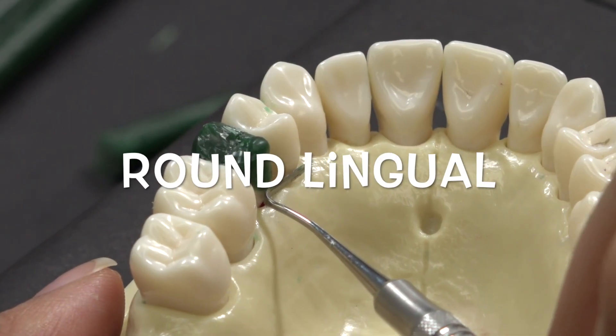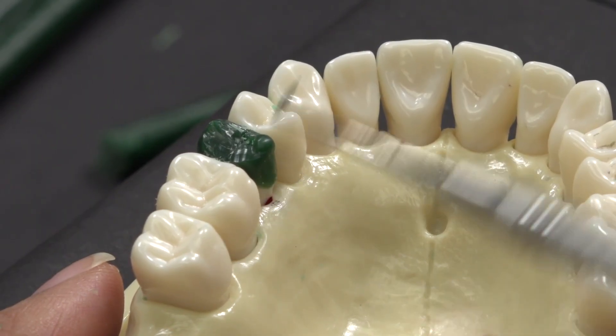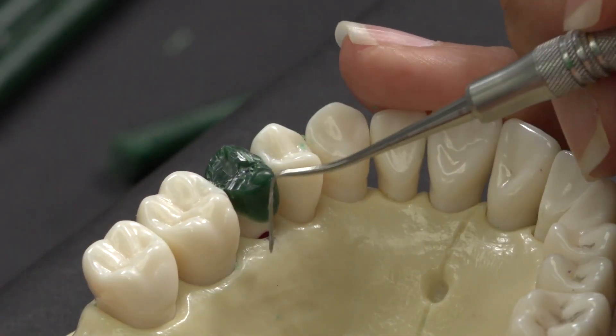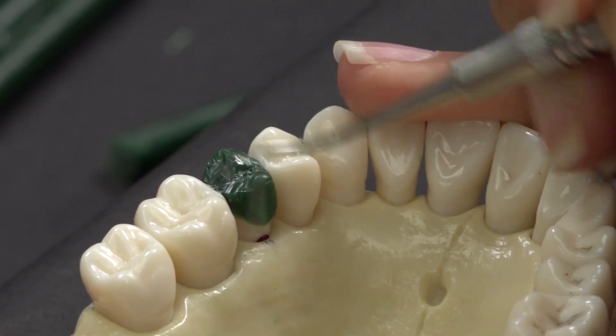Notice how the lingual is very round and constricted at the base. It should not protrude out further than tooth number 5. I place the IPC on the gum line of the typodont to help create the roundness of the lingual and to achieve the correct width.